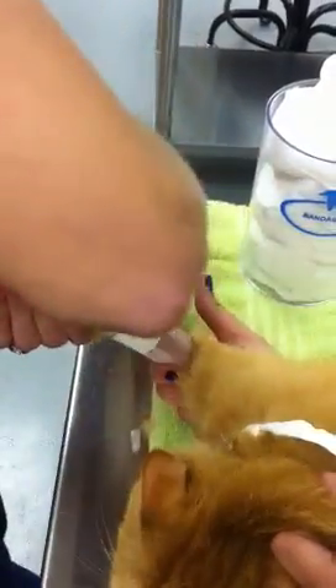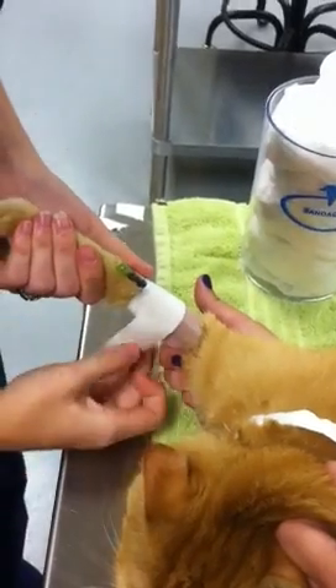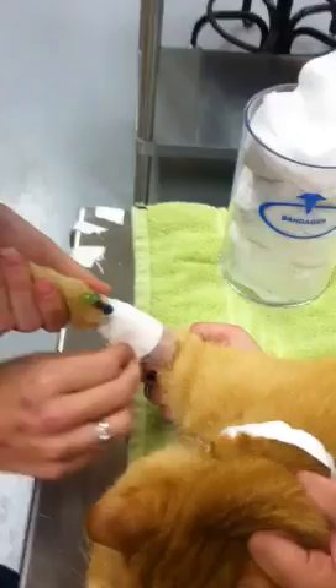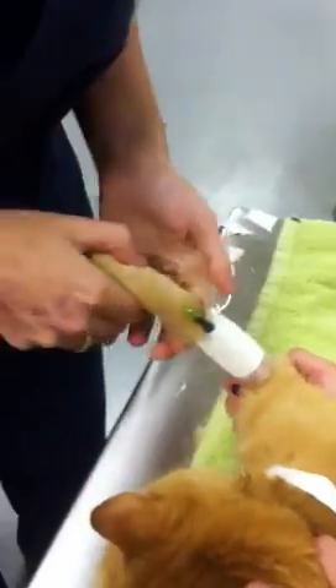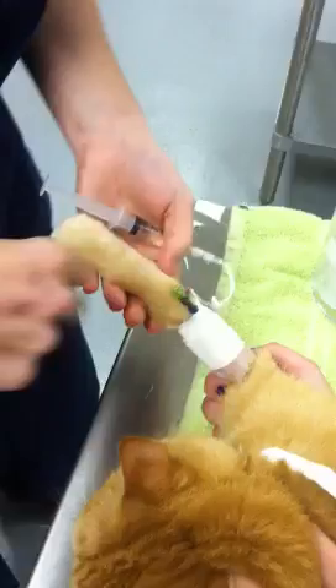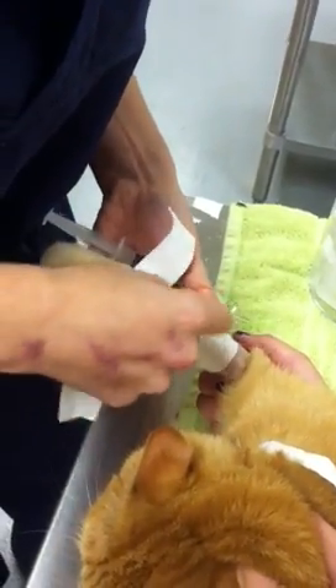I have a little bit much tape here but always better to have more than less. I'm not putting it on tight — it's very loose so that we're not restricting anything. My next piece is going to anchor the catheter from the back side.